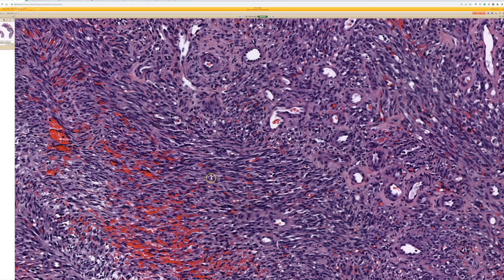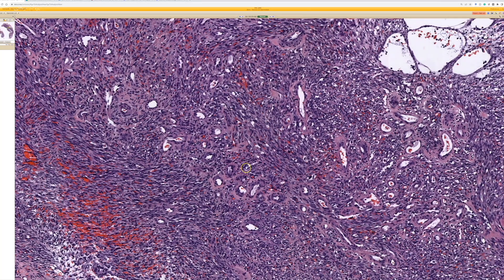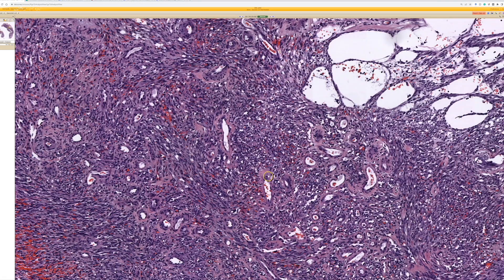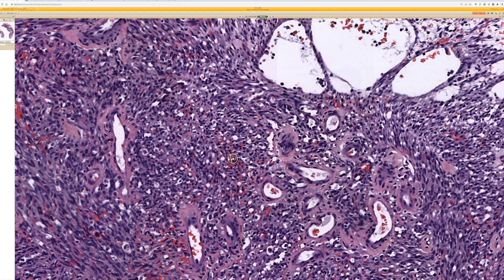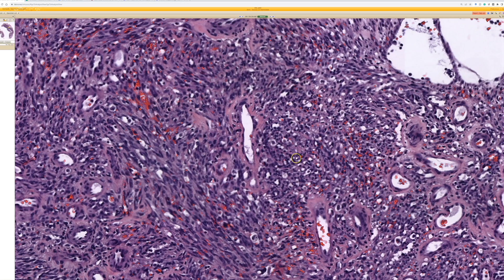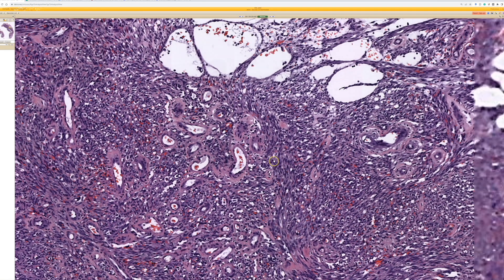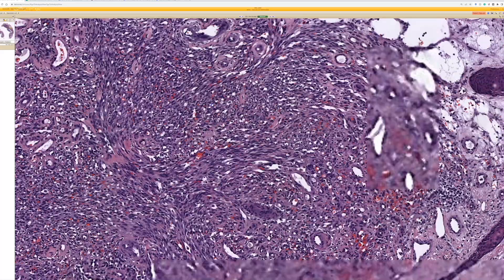Think about Kaposi's sarcoma. This is the nodular or tumor-type stage of Kaposi's sarcoma. When you cut those fascicles in cross-section, they have little holes with blood in them. People often focus on the slit-like spaces, but the little holes are actually good too. My mentor Mark Edgar described this as the sieve or colander pattern — like a spaghetti strainer — where each little hole is filled with blood.